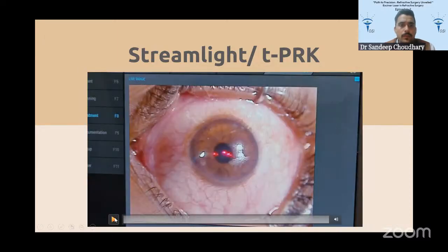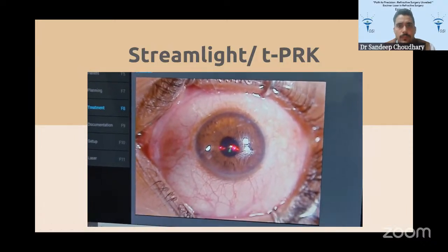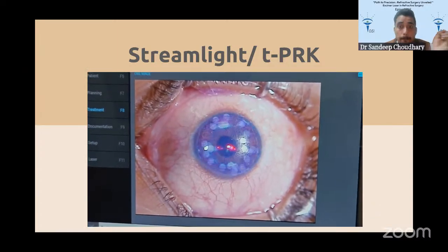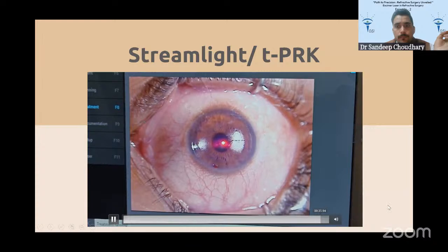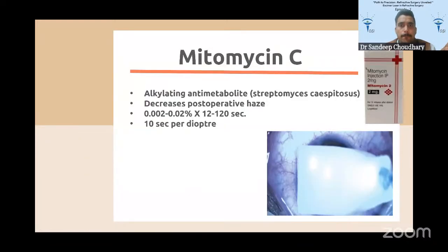So this is another video of the streamlight or trans PRK, only the magnified view, so that you can see how the machine proceeds with it. So this way the surgical timing is reduced.